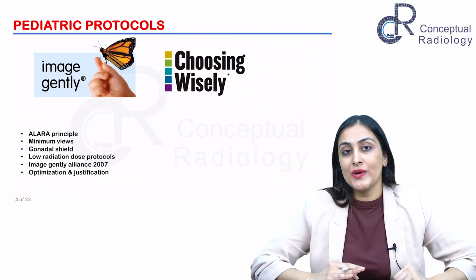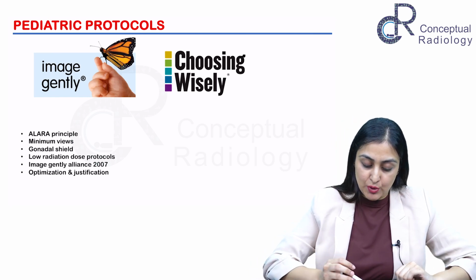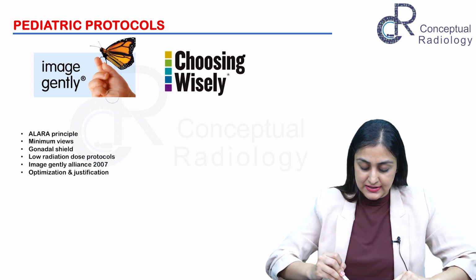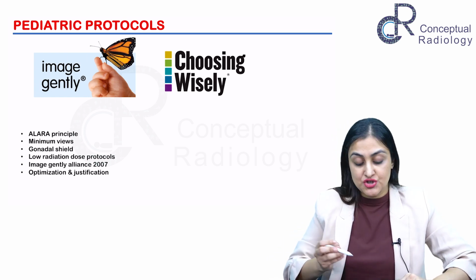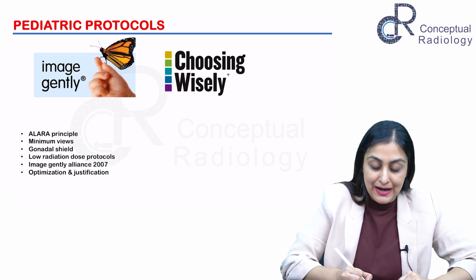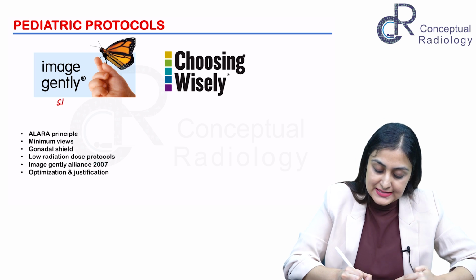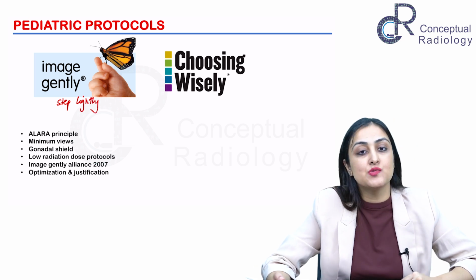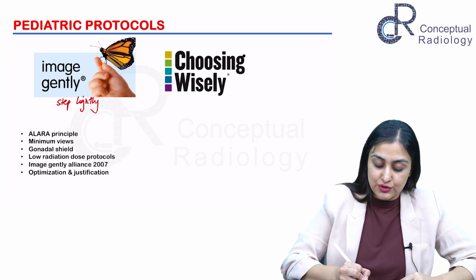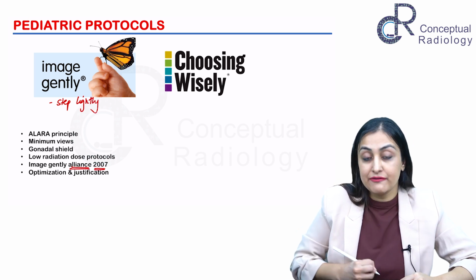Now, just a quick word on the pediatric protocols that in general we want to employ. So you guys know about the Alliance study, right? So this is the Alliance study which talked about Image Gently, and now this has been expanded. This is also an important Viva question. So Image Gently, Step Lightly, meaning you step lightly on the fluoroscopy pedal, right? We want to save as much radiation as possible. So Image Gently, Step Lightly is the Alliance 2007 guidelines.